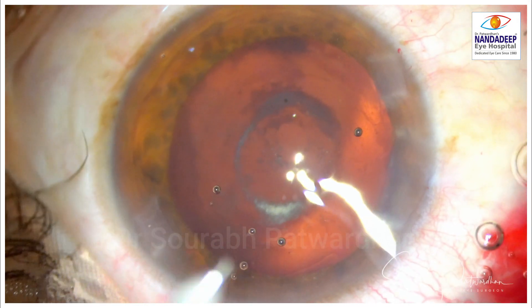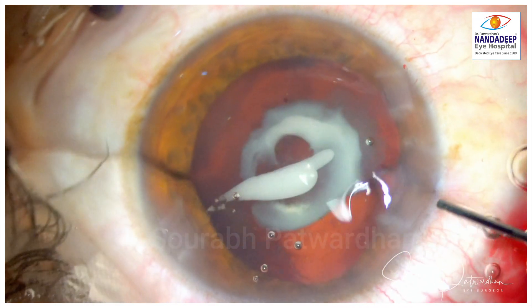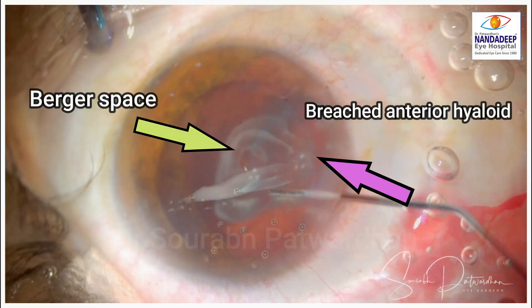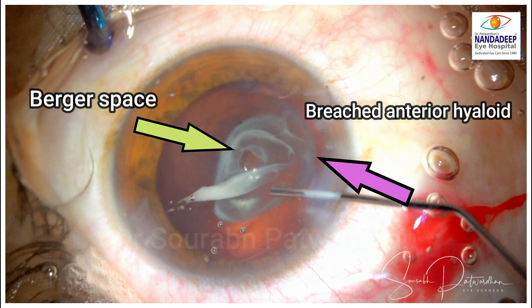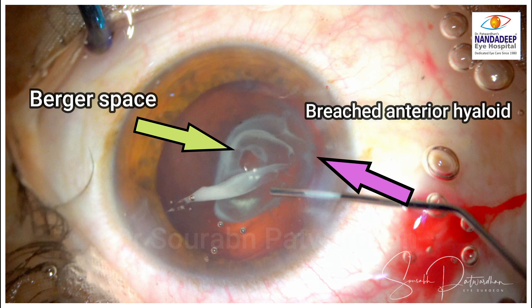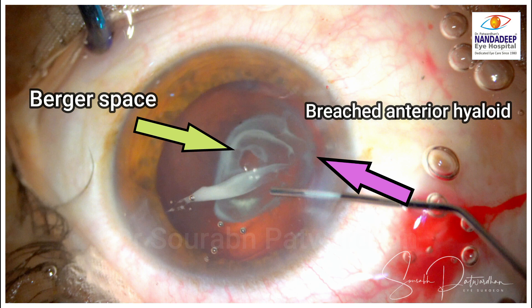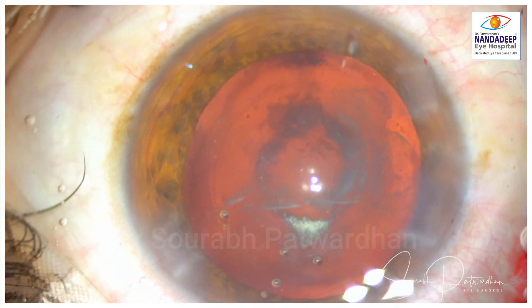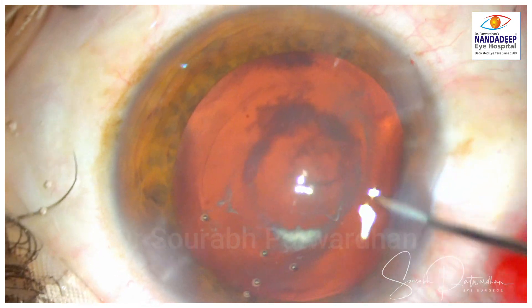Now I'm checking with triamcinolone. You can see there is a Berger space just behind the opening of the posterior capsule, and on one side the hyaloid is breached, probably because of the MVR entry I made. Through that area the triamcinolone has trickled into the vitreous. Luckily there is no vitreous entering the anterior chamber — this is what is commonly seen with posterior polar cataract, as the anterior hyaloid remains intact.